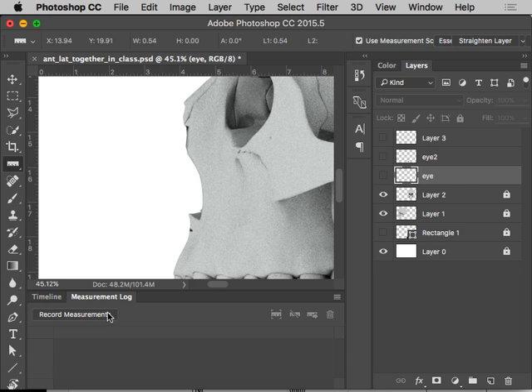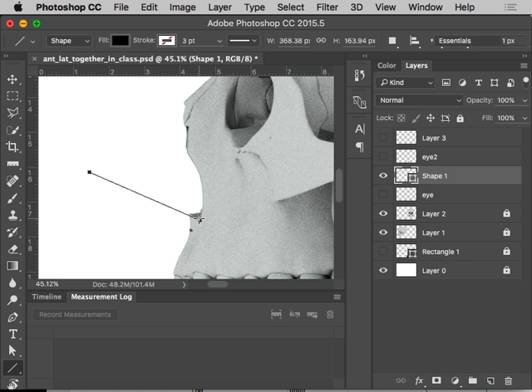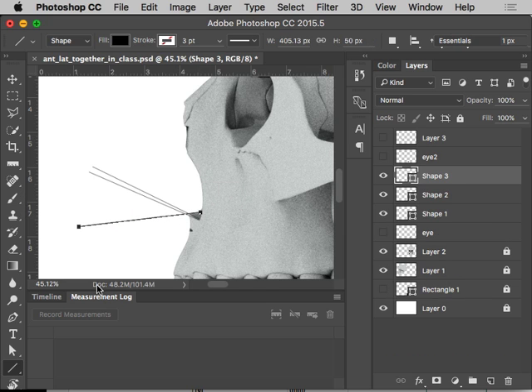Because you can imagine that one person could say, well, I think that's the general direction. But if somebody made a slightly different decision, the change is very minor down here, but if you extend that out, the result starts to expand over space. And if somebody decided we're supposed to measure it this way along the top, then you get a totally different result. Others might interpret it as following the maxilla, or the external surface, which is obviously wrong, but you can see that there's a lot of potential for error here.